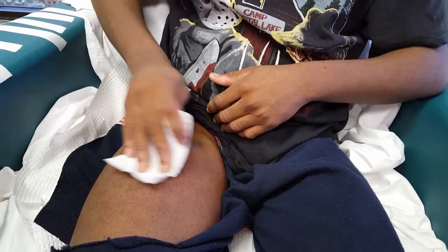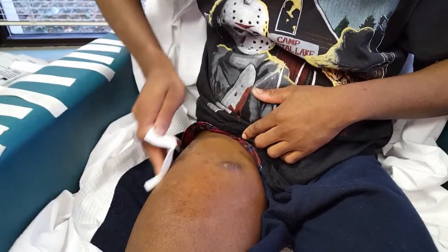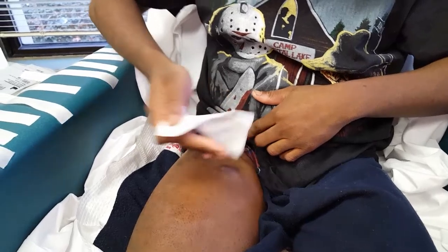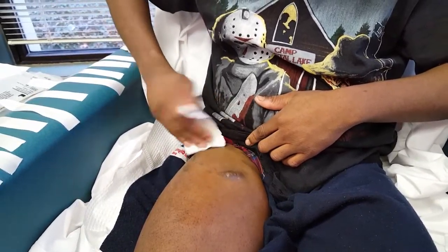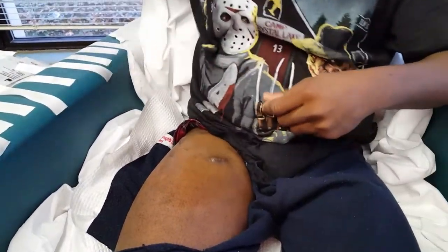Go ahead, Kyle. So now we're going to start cleaning it. Cleaning the graft, so that no dirt or germs get in it. Because if any germs got in it, then it would be in my bloodstream. Then I clean my fingers.